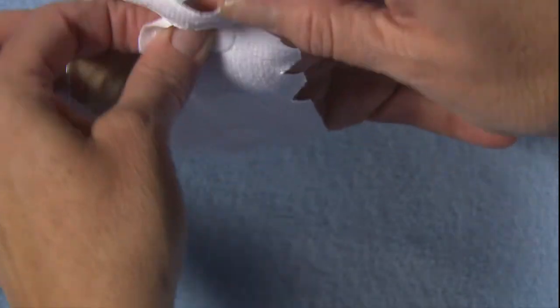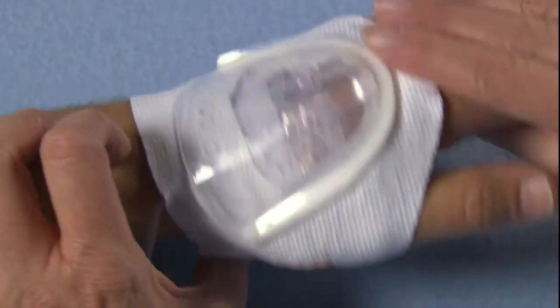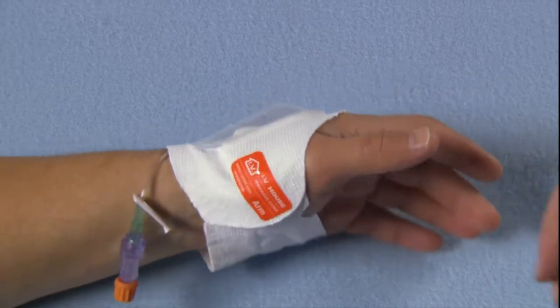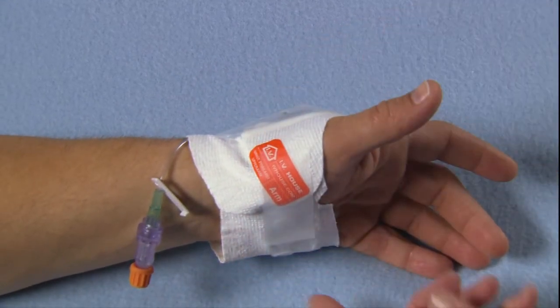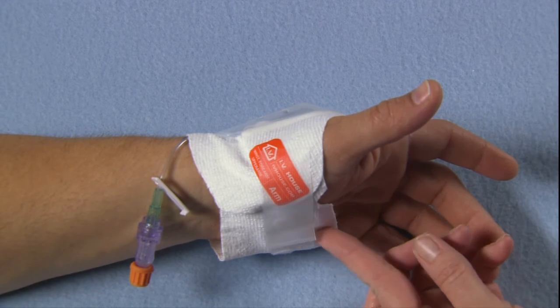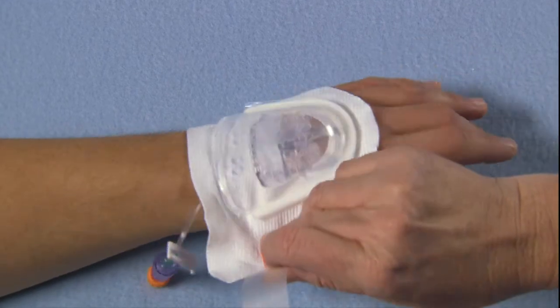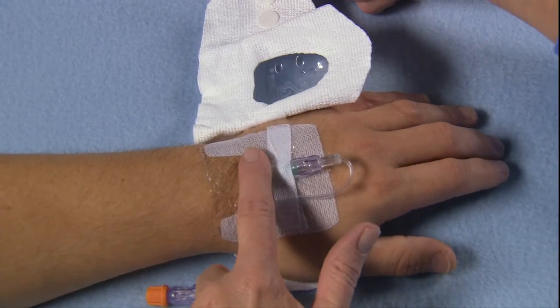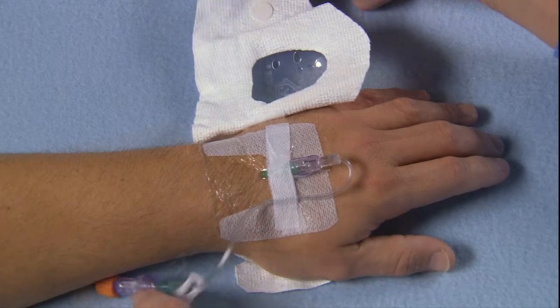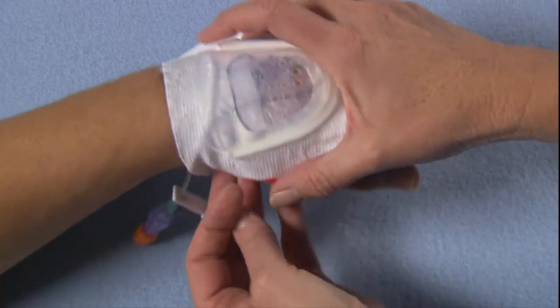Close with Velcro. A piece of tape on the fabric may be used for a more secure closure. Fold back the end of the tape to create a tab — later, this will make finding and lifting the tape easy. Inspect the IV site by releasing the Velcro tab, lifting the dome, and viewing the entire site.